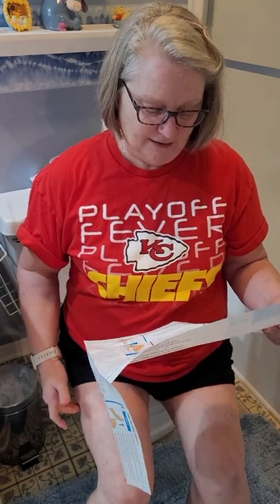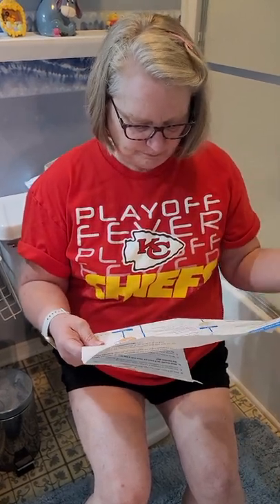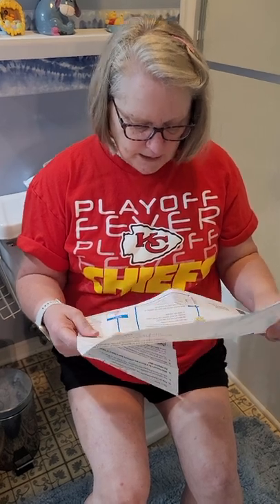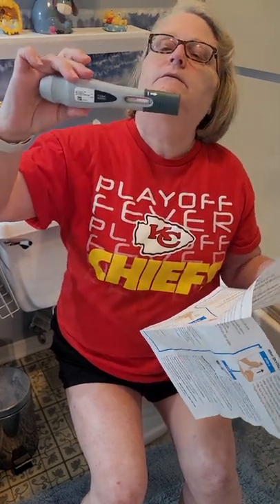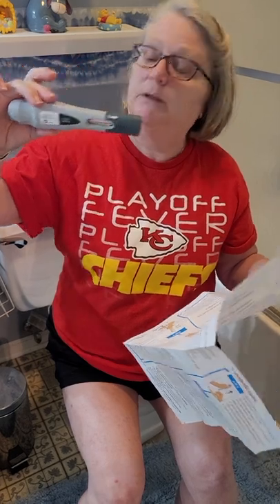We're going to do my thigh. I already cleaned it. And then it says we're going to pull the cap off. Check to see if the liquid is cloudy or contains flakes. I see nothing in there — no cloudy, no flakes. The bubble is okay.